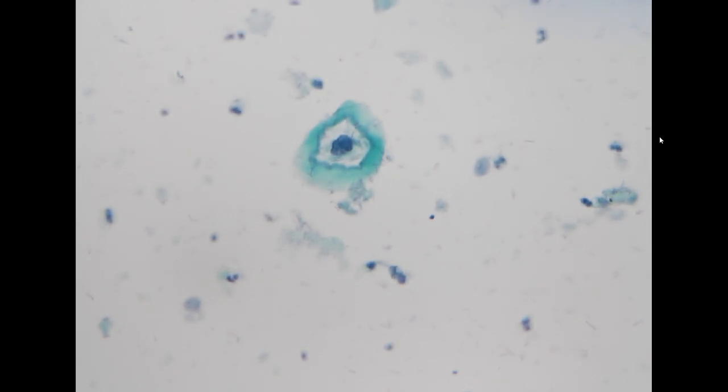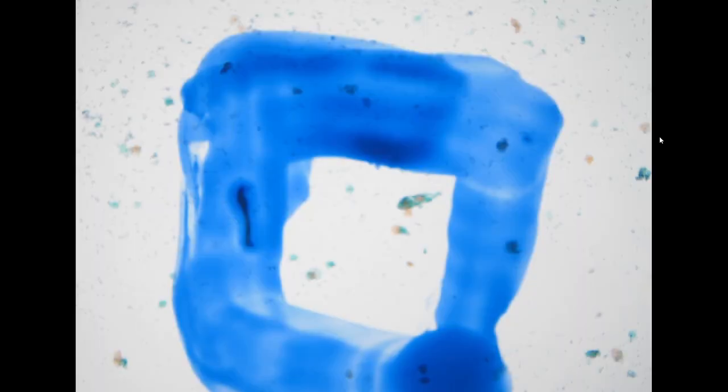So here in this specimen, we only see one single cell with koilocytic change and binucleation, but very small nuclei. Because there's only one of these, we decided to call it ASCUS.